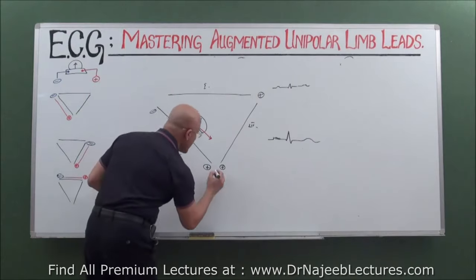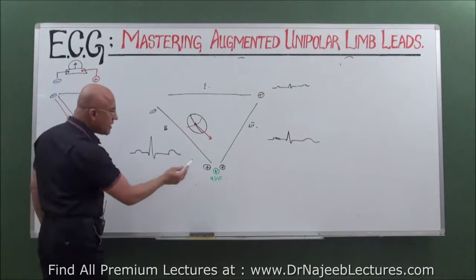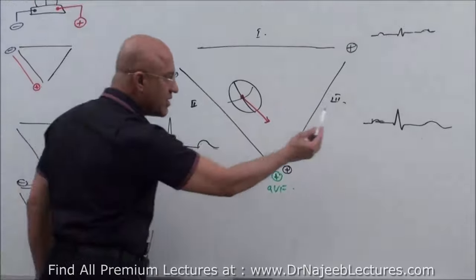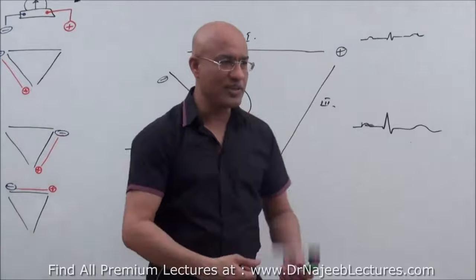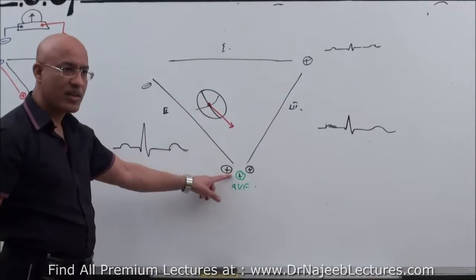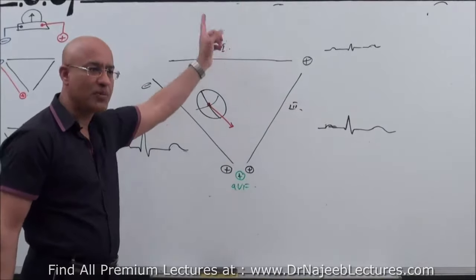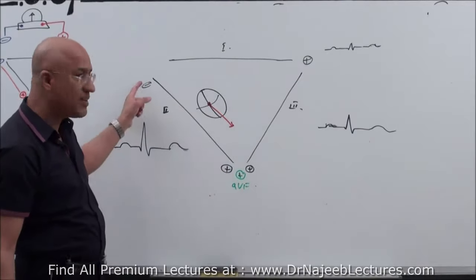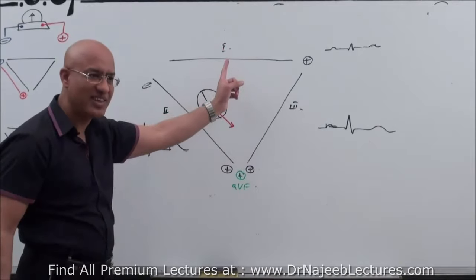Now here I put the pattern of AVF. Now look at it. The AVF pattern will be somewhere between lead number 2 and 3. You are understanding? Someone is looking at electrical activity from the heart, from down and rightward, down and leftward, down and upward. Looking from down, upward. This is upward and rightward. Upward and leftward.